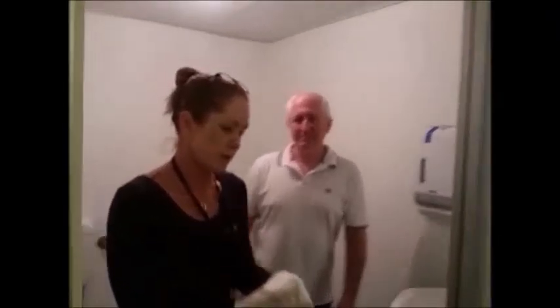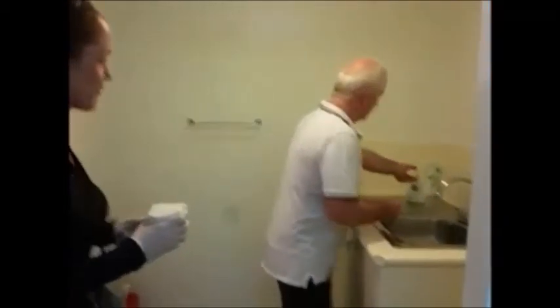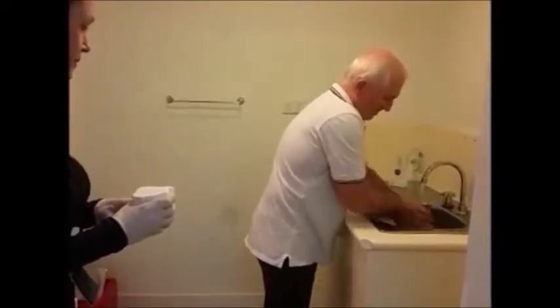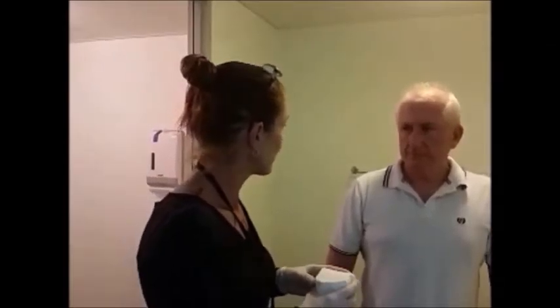All right, Michael, come on out. I just get you to wash your hands with soap now, please. On the left, yeah. Always ensure the entire time that the donor and you are staying together and that the donor is in full view of the sample. Make sure that it's covered so it's not in view of anybody else that may see you going back to the testing room. Okay, Michael, let's go back to the testing room.